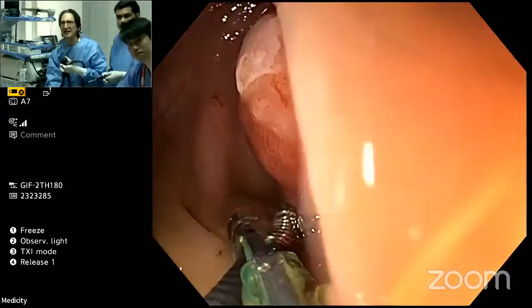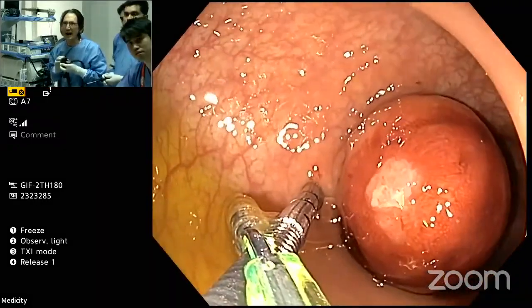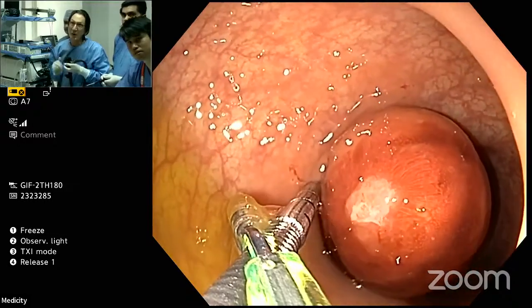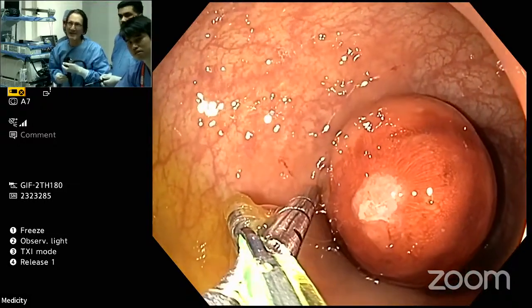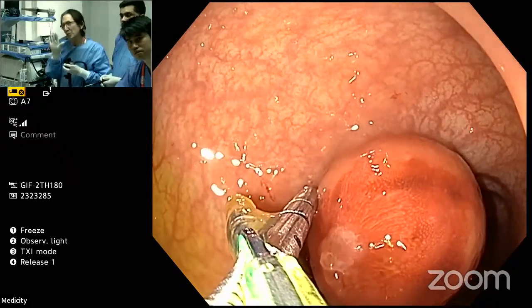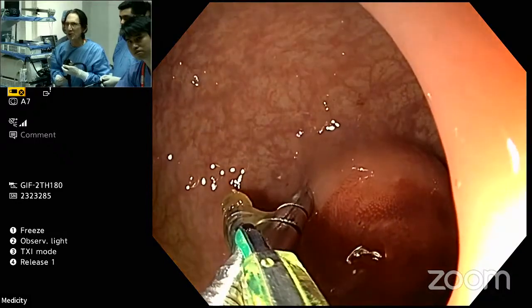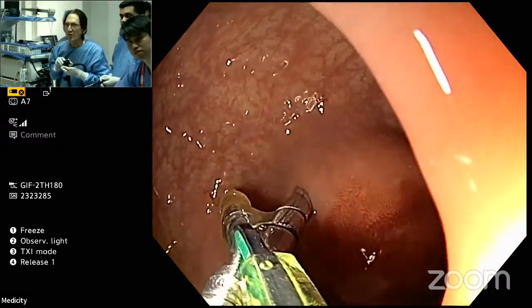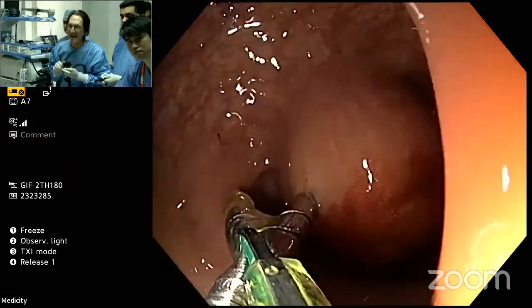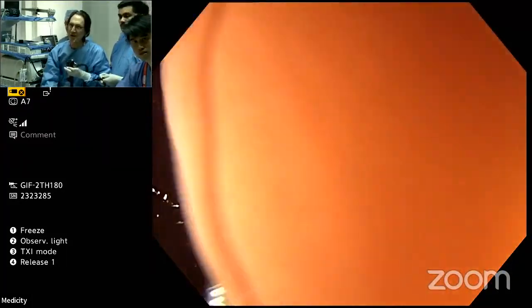So as mentioned, I don't think the stiffness is that critical in a case like this, but it is a case where you have a lesion that is very much flatter, has a broader base, and then you really need a loop that pushes flush up against the bowel wall. So now I'm going to move my three-prong grasper over a little bit, and as soon as I have a good view, it's just a very difficult position because we're in the sigmoid.